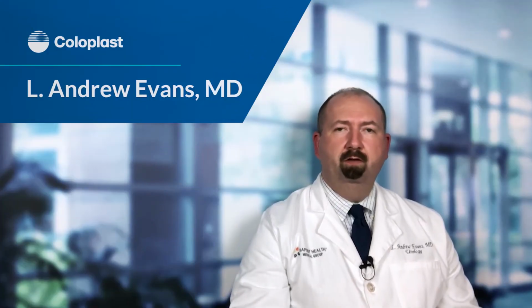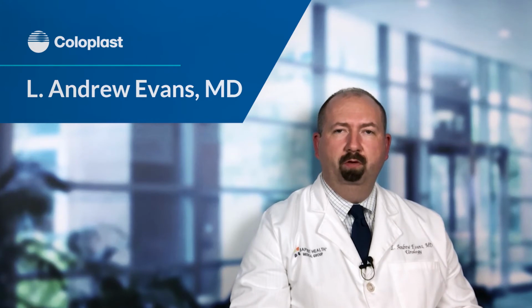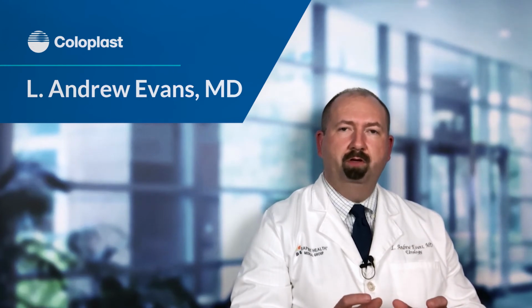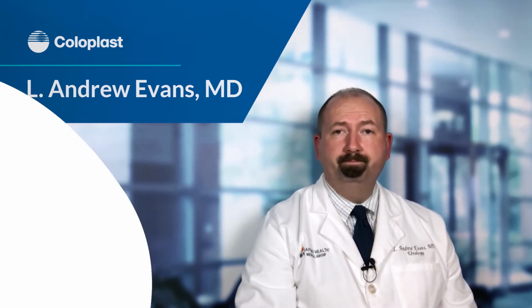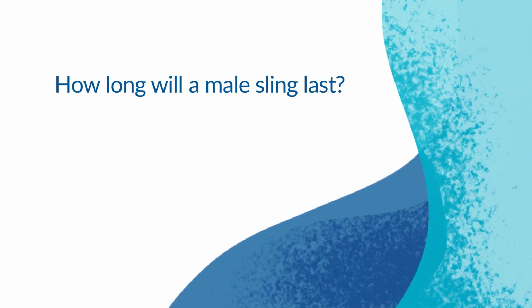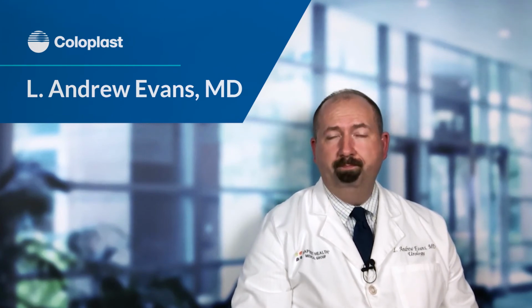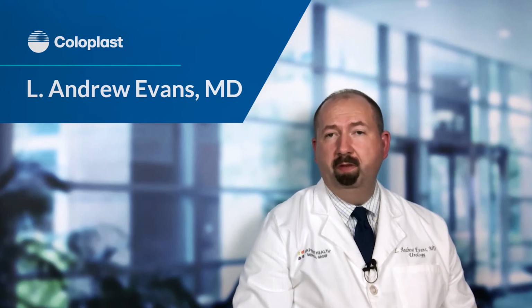The male sling works to restore the support to the urethra that is no longer present after prostate removal. This pressure that's applied from the sling relocates that proximal urethra closer to the bladder neck to restore that support. A male sling will generally last for the rest of a man's lifetime and provide a durable, effective treatment option for many years.